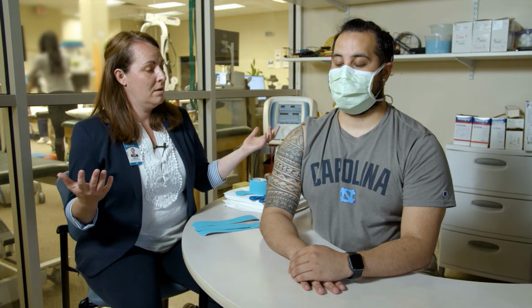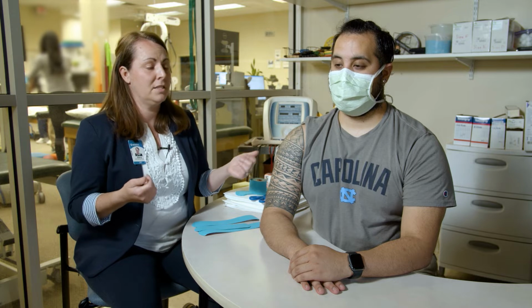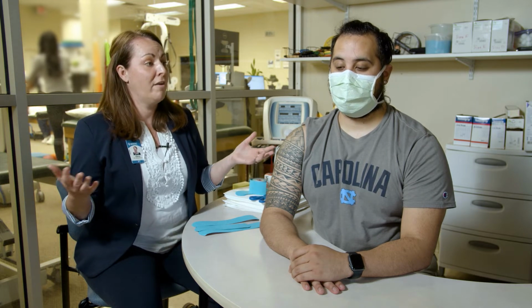Typically, when we have patients tape or we have people in the community tape, athletes, they're doing it to help mitigate pain, decrease pain, and also to help improve normal functioning and movement. When you have pain reduction, you tend to move better. So the idea of tape is to decrease that pain, to increase more normalized movement.